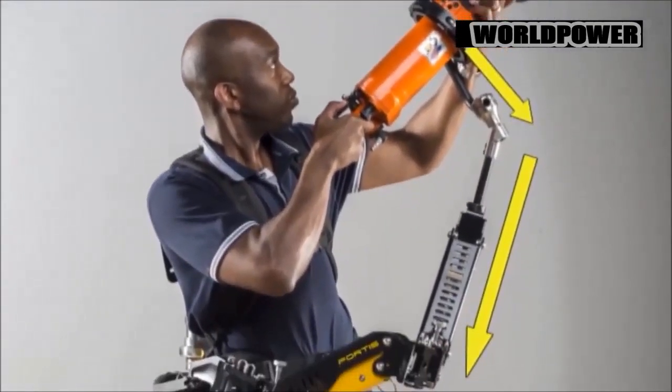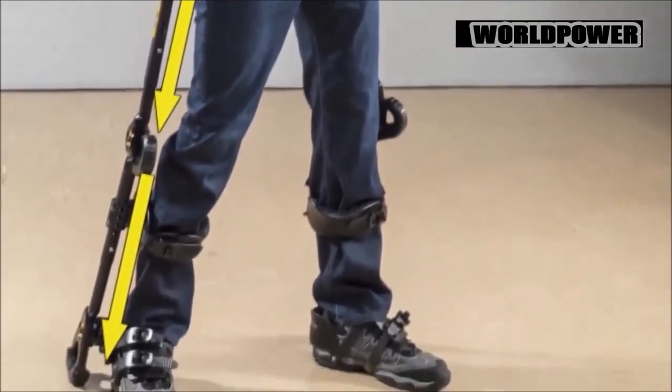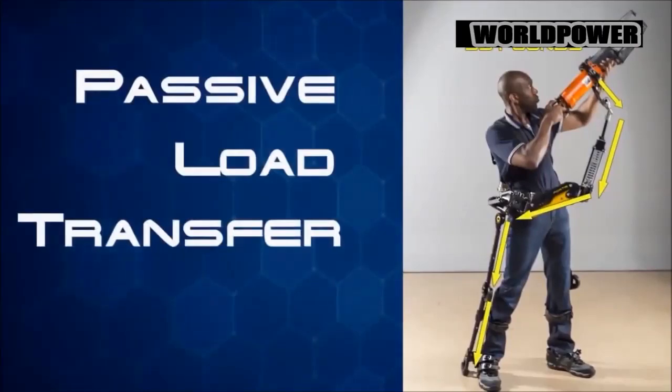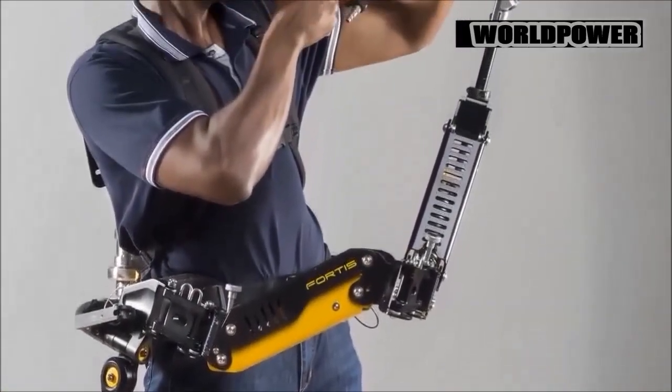Fortis uses a three-pound, rechargeable BB-2590 lithium-ion battery. Developed by Lockheed with internal research and development funds, Fortis is designed to help soldiers run, maneuver, carry injured comrades, and perform a wide range of combat tasks while preventing hyperextension of the knee.